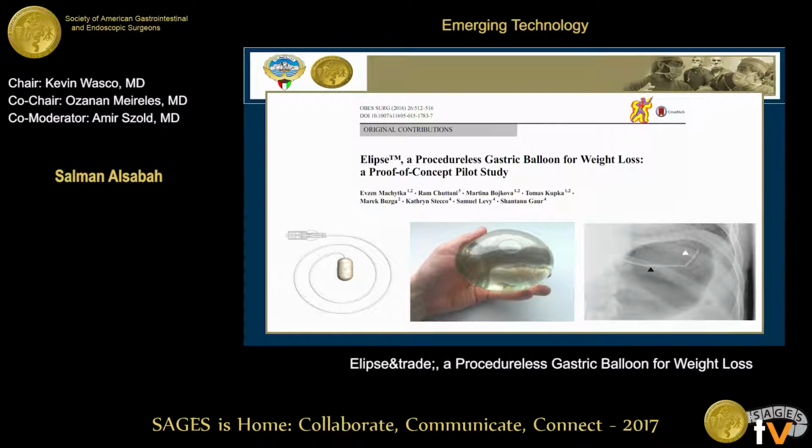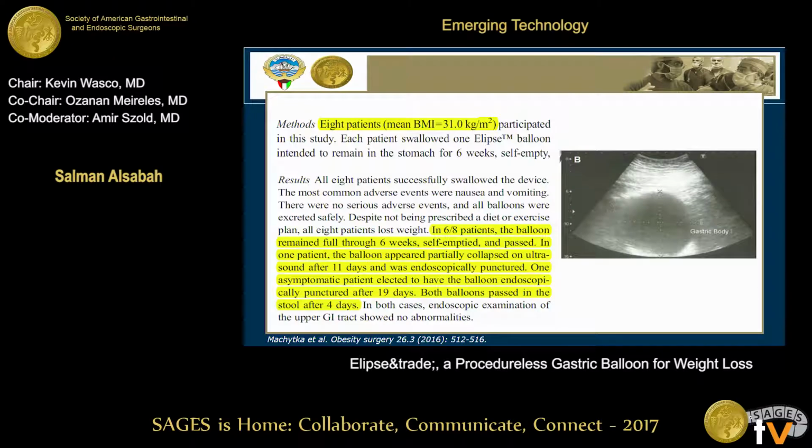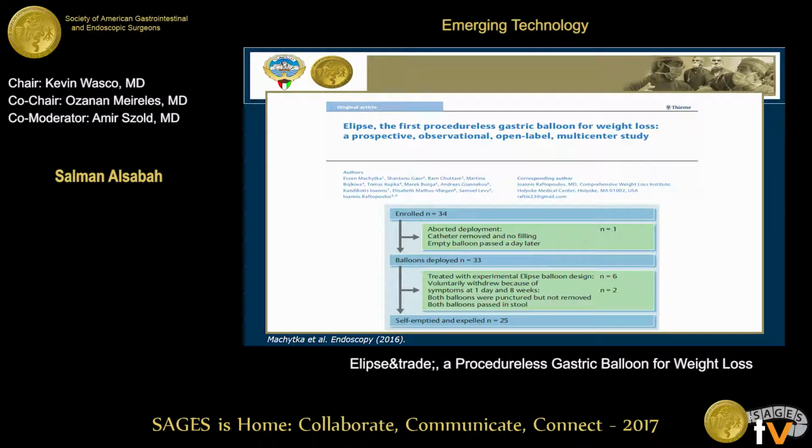There are only 2 publications that just came out this year. They have the Elipse balloon here. This was published in Obesity Surgery, with experience in only 8 patients. They showed the safety and effectiveness of this balloon in only a small number of patients. This was followed by another study published in Endoscopy this year.